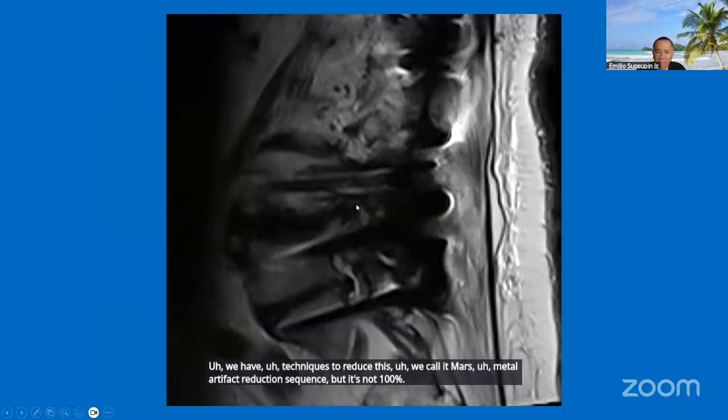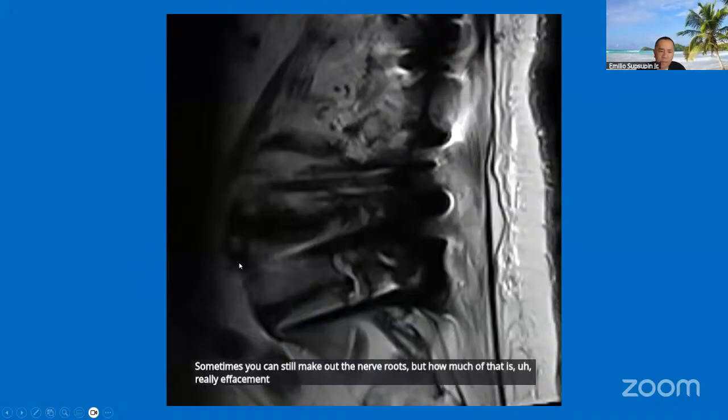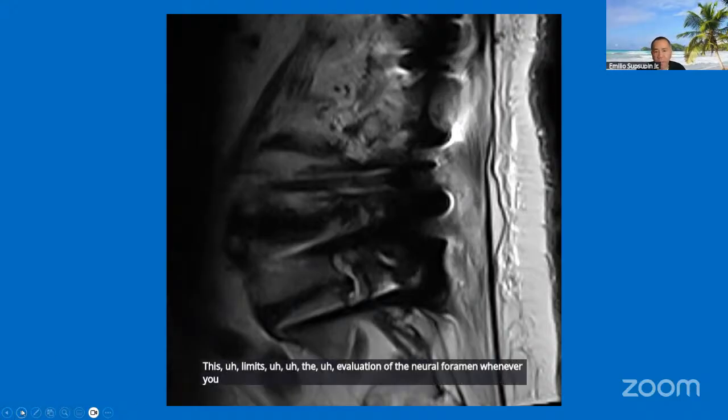Sometimes you can still make out the nerve roots, but how much of that is really effacement or just the abnormal dark signal encroaching on the neural foramen is anyone's guess. So this limits the evaluation of the neural foramen whenever you have instrumented hardware.